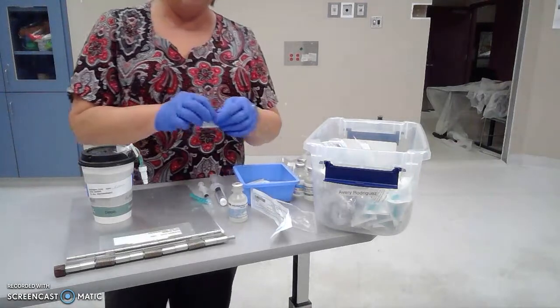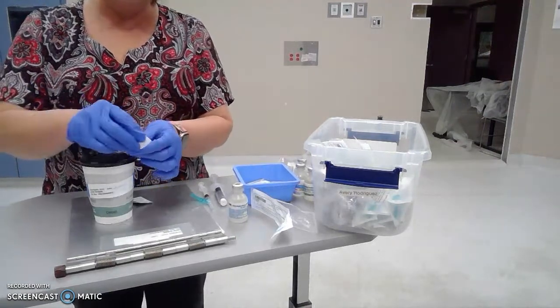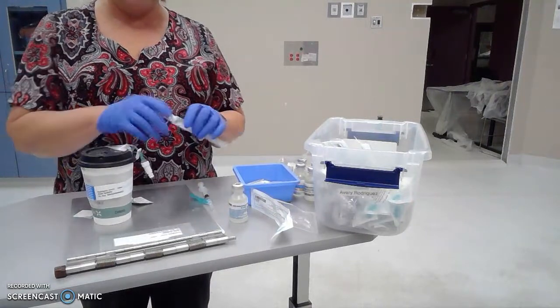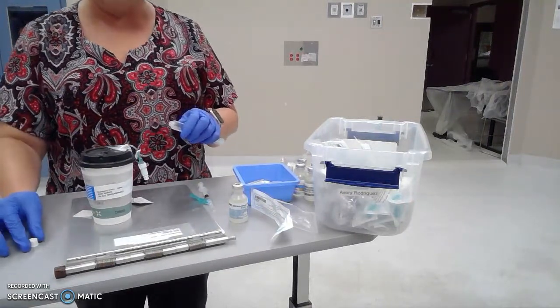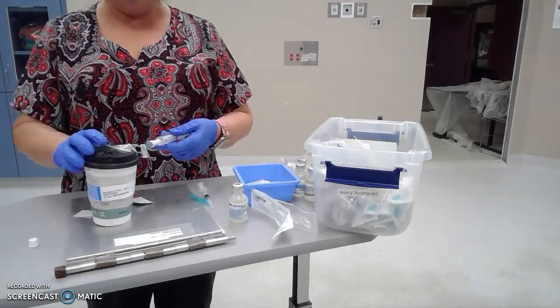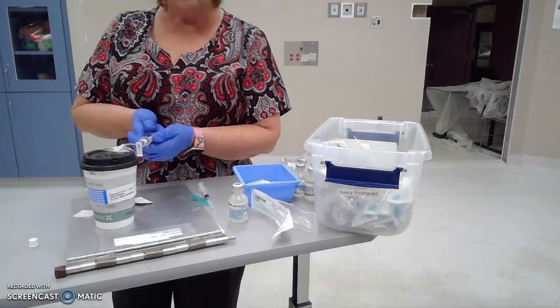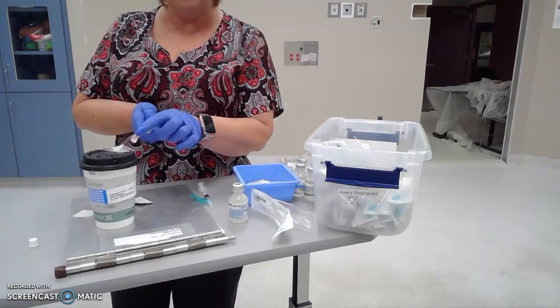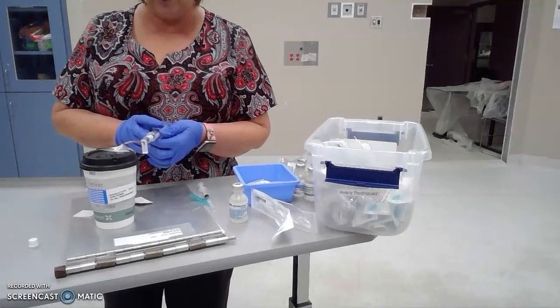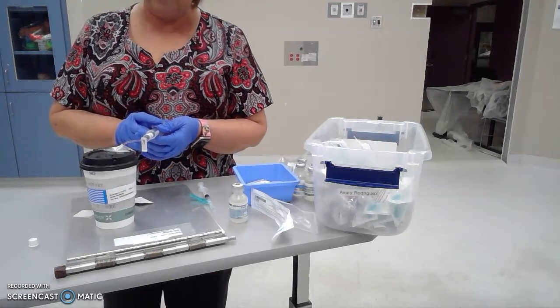I am taking my alcohol. I'm cleaning this port. And the first thing I have to do is check to see if this IV site's any good or not. I don't know that. So I hook up my flush, and you always pull back and aspirate. You see I got a little blood return, so I know that's good. Now I'm going to push or flush 5 milliliters.